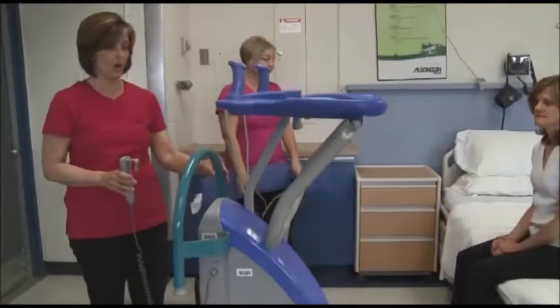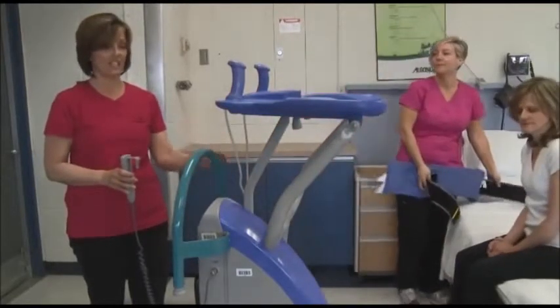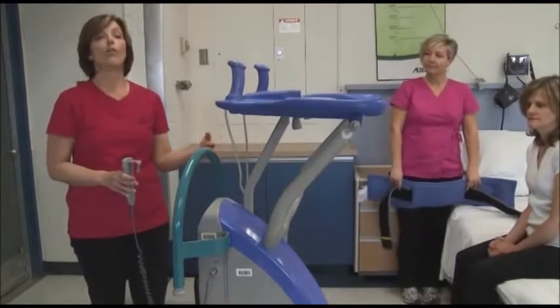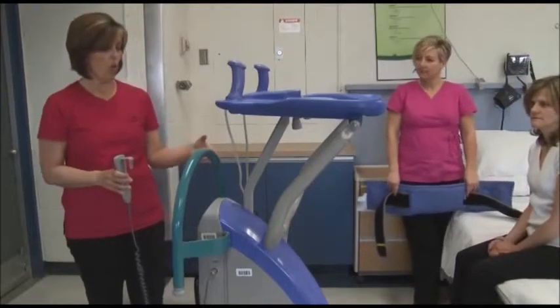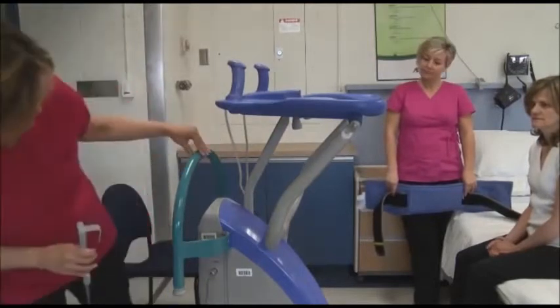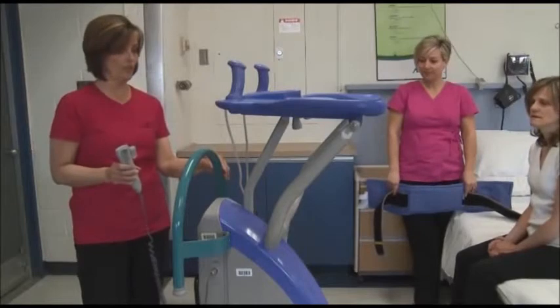Okay, so today we're going to demonstrate the sitting to standing lift. This particular brand is by Arjo Huntleigh, and they call this, actually it's a Sara lift, a standing and raising aid, or I think this one is actually called the Encore, is another one that you will hear it referred to.